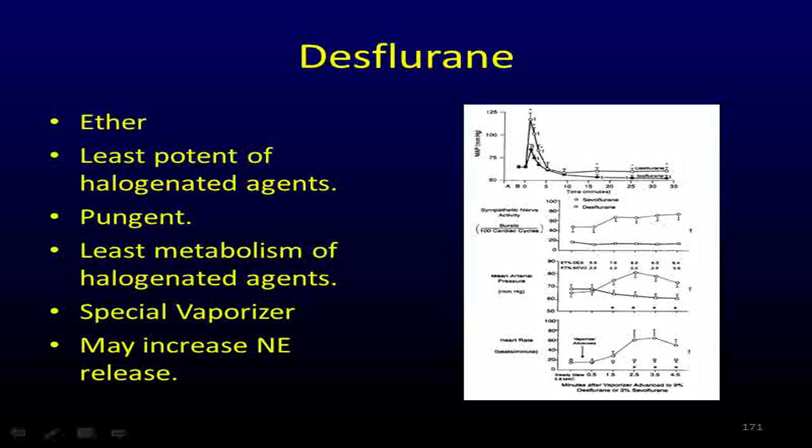But the Tec 6 vaporizer, you want to learn a little bit about that. It has to be heated and it has to be pressurized. Both have to happen. Because, can you take a desflurane vaporizer with you in the field? No. You could, but you'd have to have a constant supply source because the vaporizer is the only one that needs an outlet to work. It has to be plugged in to be heated.